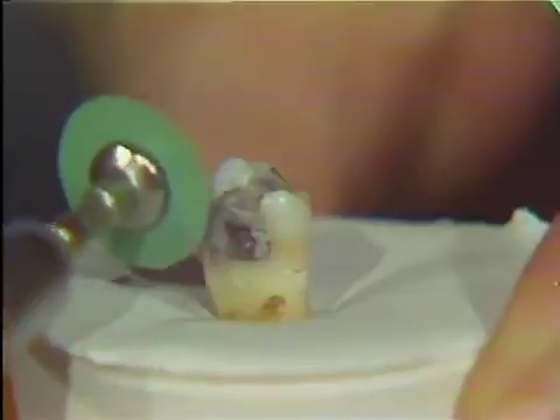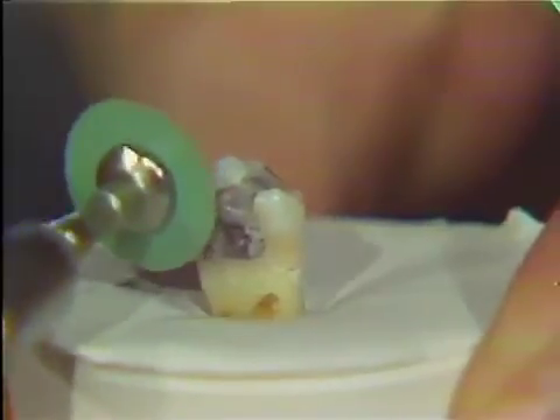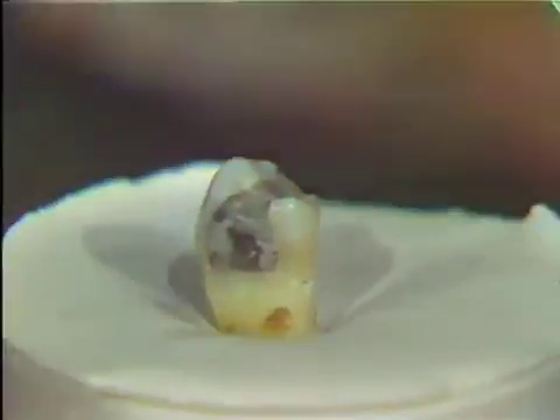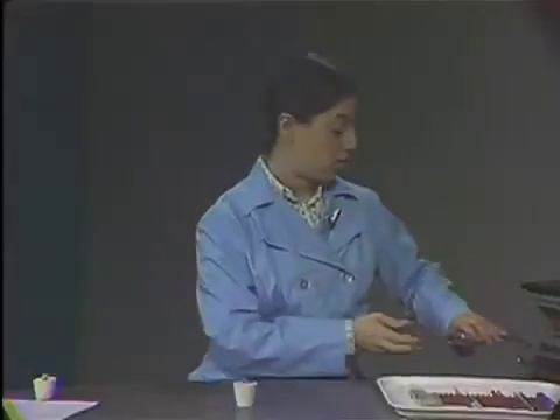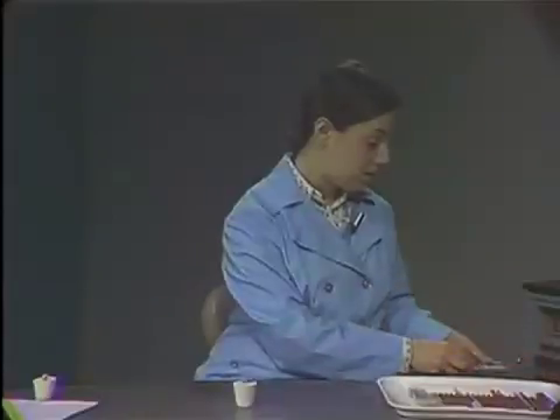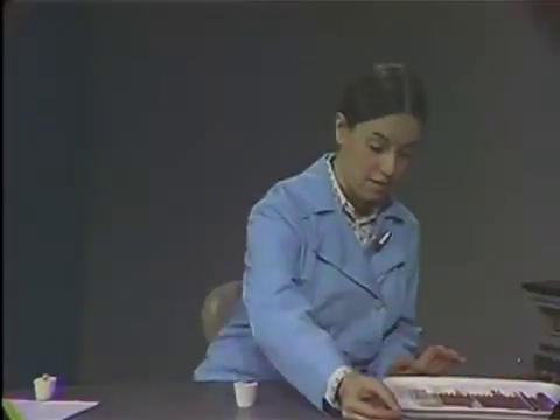Polish only the buccal proximal and lingual proximal surfaces of the amalgam. The concluding steps to finishing the polish of a class II amalgam would be to use finishing strips. Point the strips on one end, then thread it through the contact — don't bring it down through the occlusal of the contact, but thread it through the teeth. Otherwise you may abrade the contact and ruin the interproximal anatomy of the class II. After you've used your finishing strip, you may go ahead and use dental tape and pumice as the very final step on a class II.